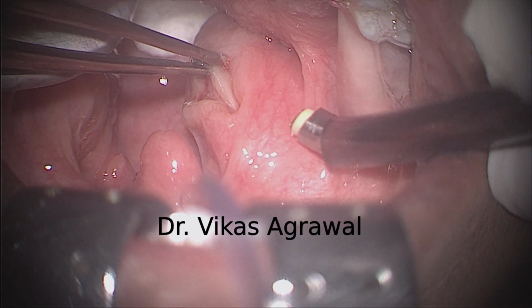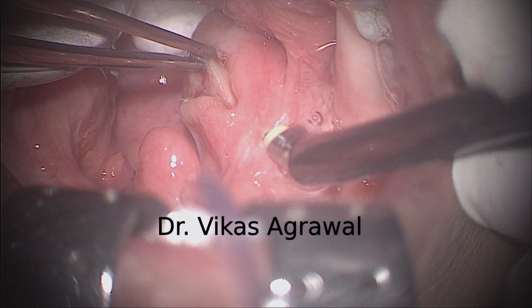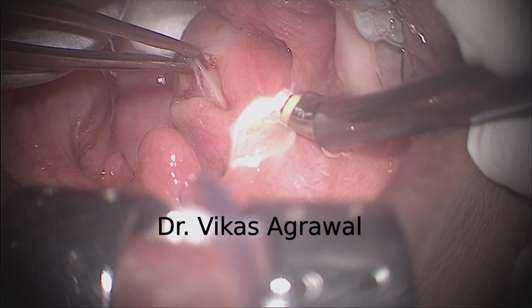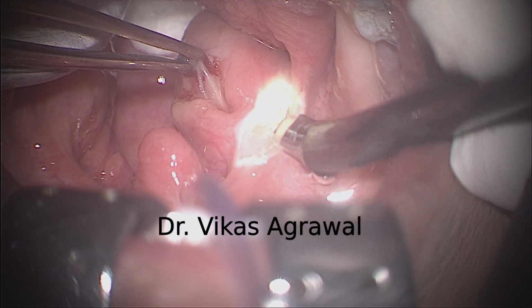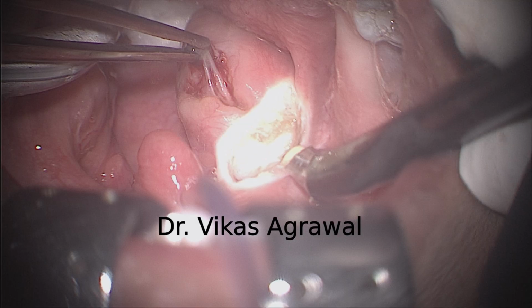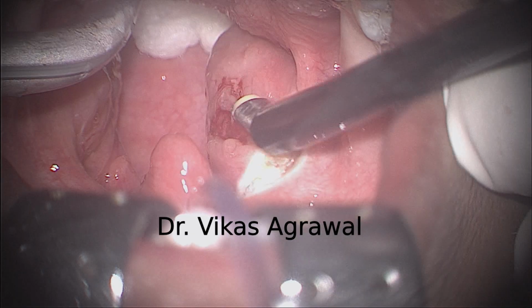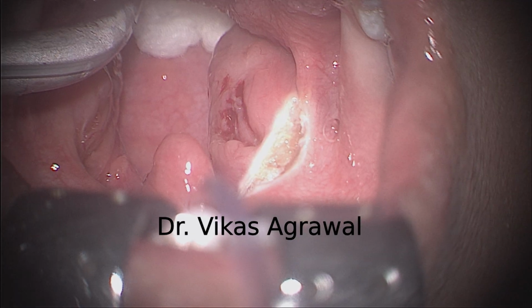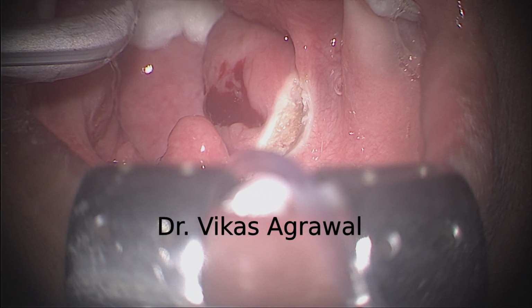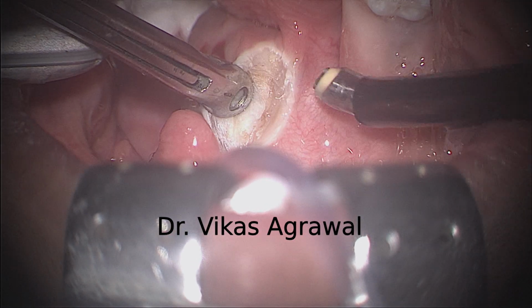Now I'm starting on the right side with coblation by Smith and Nephew at the setting of 7 for ablation and 3 for coagulation. Alright, so this is my marking, and I'm supposed to reach the plane in the first instance, because if I do not reach the plane correctly, there will be a lot of bleeding. So I have already reached the plane. I'll show you the plane in a moment. That's the plane.